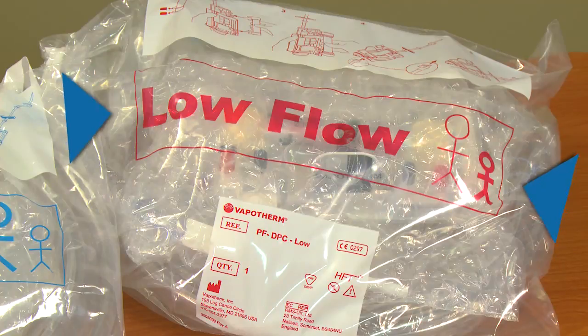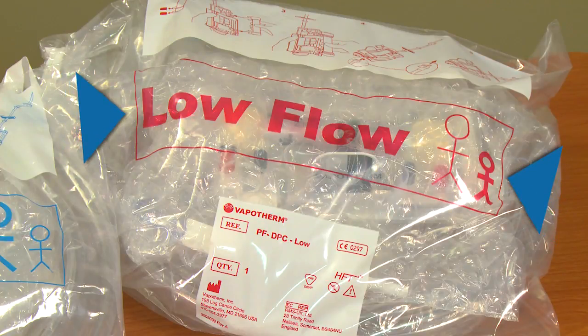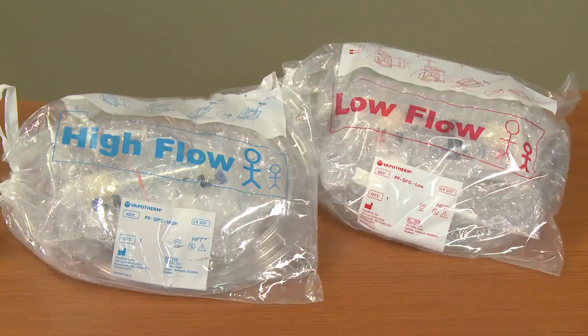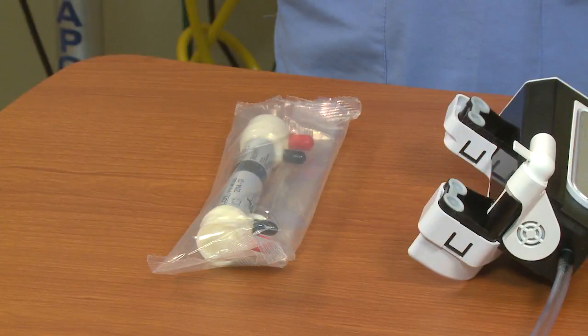The second kit, marked in large red lettering as low flow setup, is specific for the NICU neonatal population and is to be used with only the premature, neonatal, and infant cannulas. The flow range for this kit is 1 to 8 liters per minute. Both disposable kits can be used for up to 30 days of single-patient continuous use before required replacement.